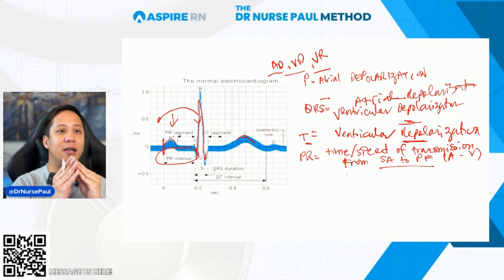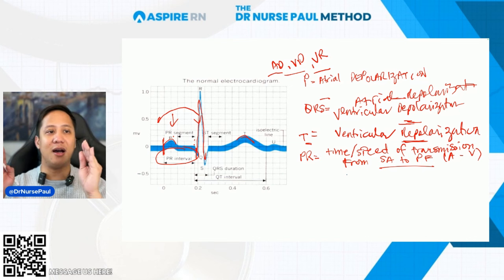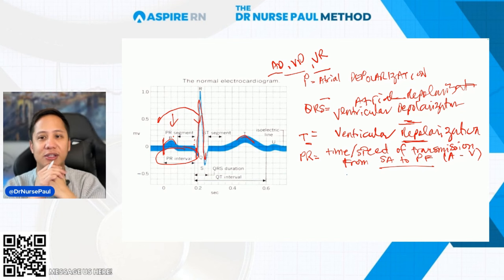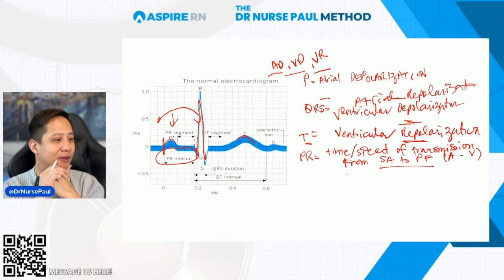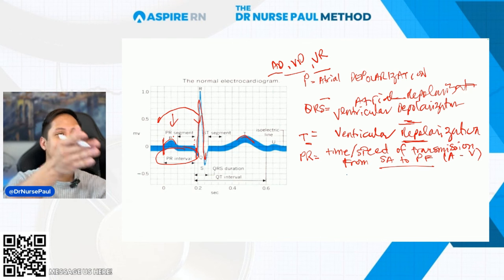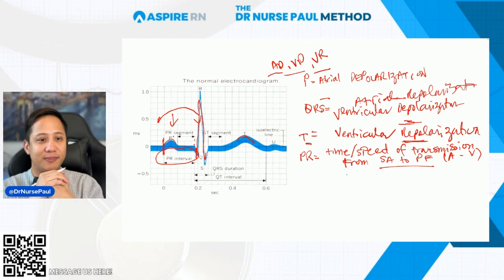If the PR is prolonged and PR talks about the speed of transmission, and the PR is prolonged, wider, getting longer, is the heart rate fast or slow? Analyze. I've only seen less than 10 answers so far, and we have more than 150 people combined watching me, from my students to the live stream. That means it's slow.